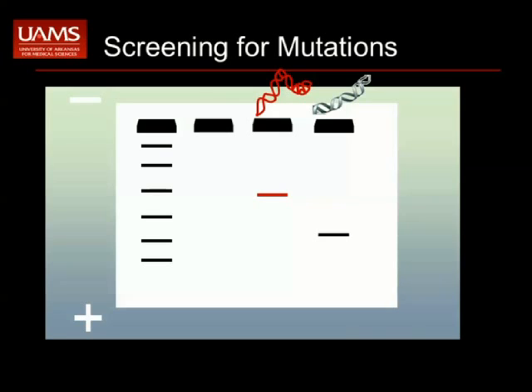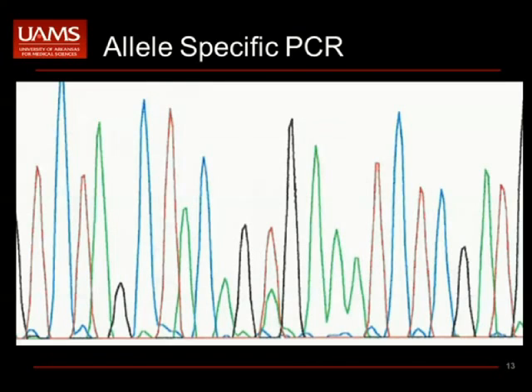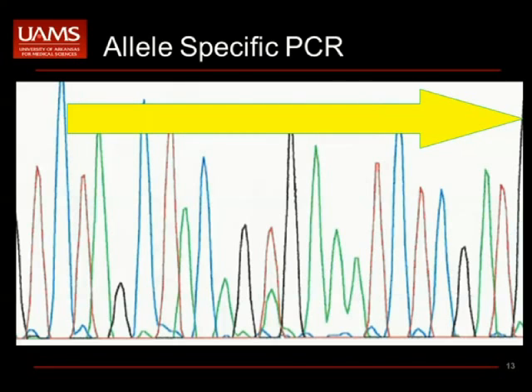And we're going to talk about the mechanisms to analyze many of the different components in this, especially the ones that are oncogenic. So KRAS has been mentioned over and over again, codons 12 and 13. If you do this type of analysis, you know that GGT, GGC, backwards, forwards, every which way. Actually, that green box got shifted a little bit.